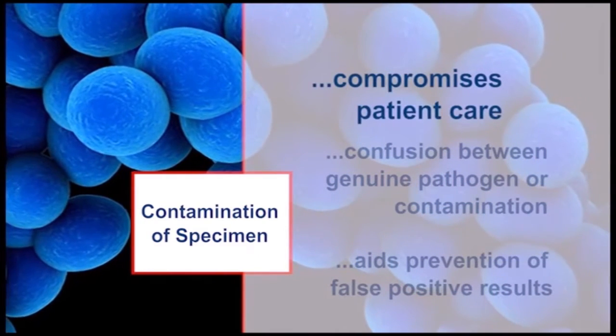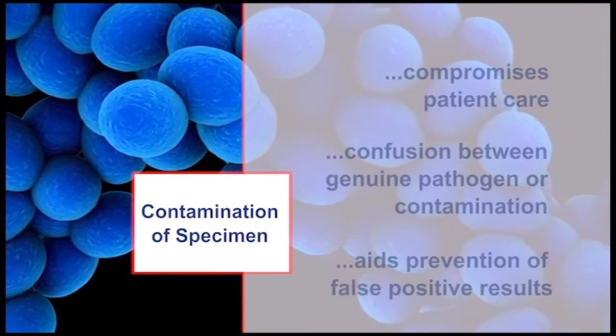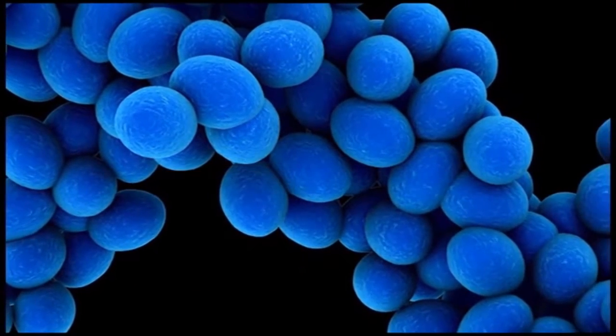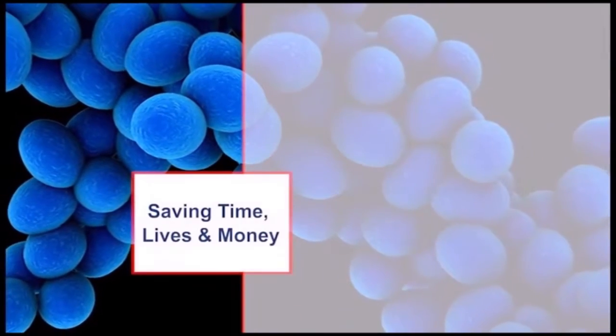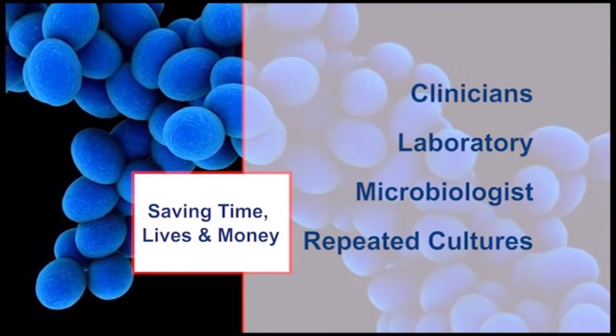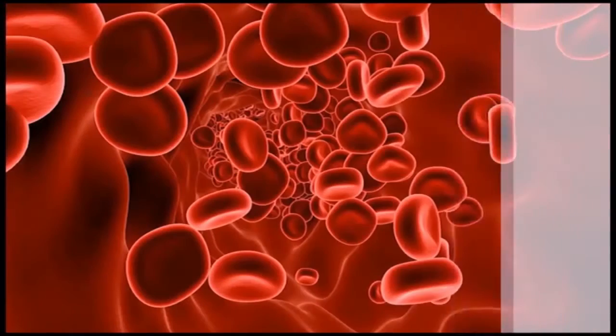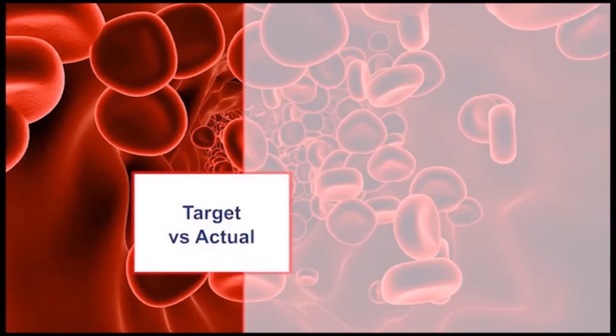Contaminated blood cultures may compromise patient care by prolonging their hospital stay and exposing them to unnecessary antibiotic therapy. It also leads to needless engagement of clinicians, nursing staff, medical laboratory scientists, and unnecessary repeated blood cultures.